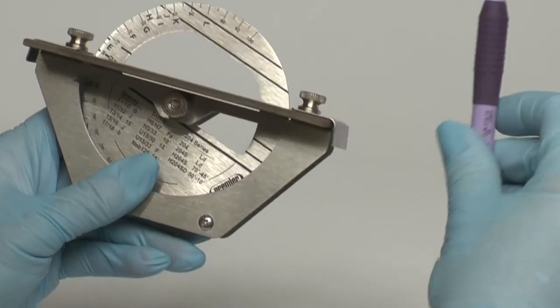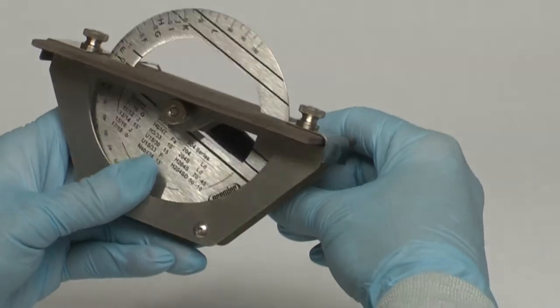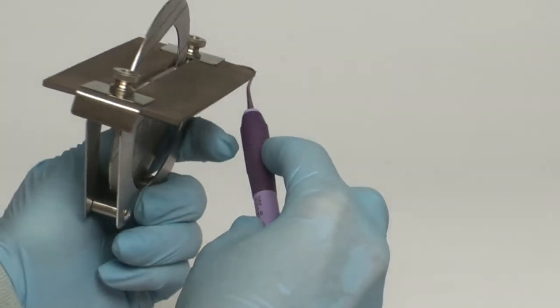Flip the instrument to sharpen the opposite end on the rear stone. The handle is aligned with the bold reference lines and repeat the same sharpening step.